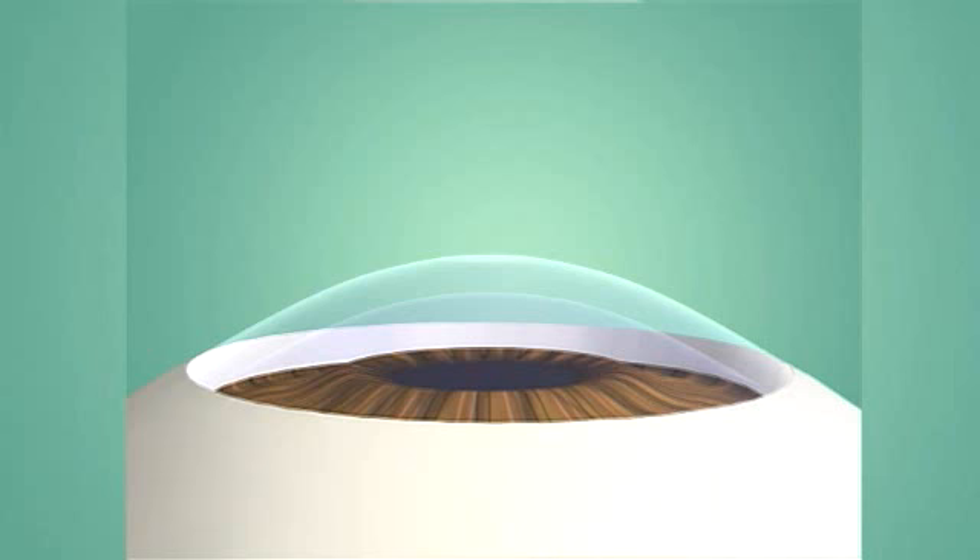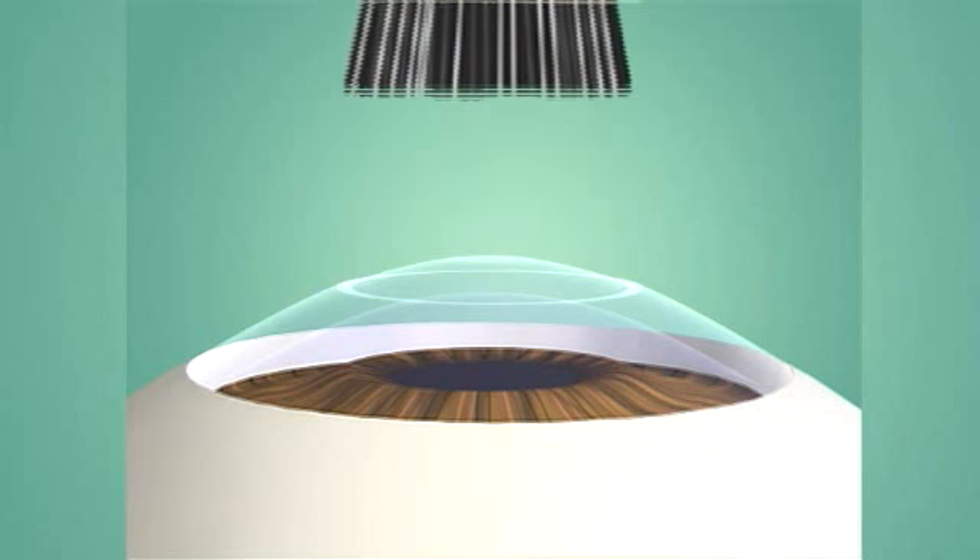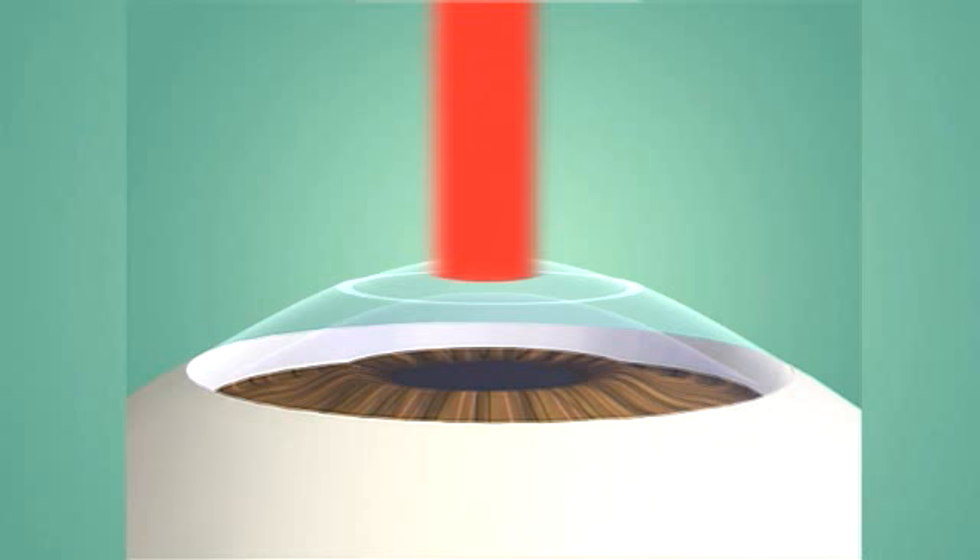With PRK, the epithelium or outer surface layer of your cornea is removed. An excimer laser, controlled by a computer, is programmed to reshape your cornea.